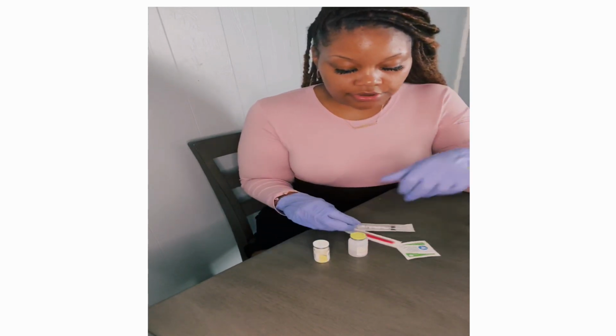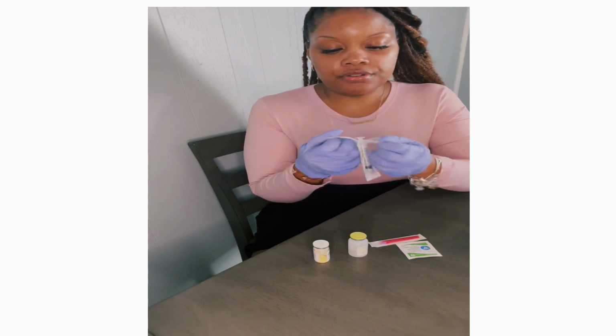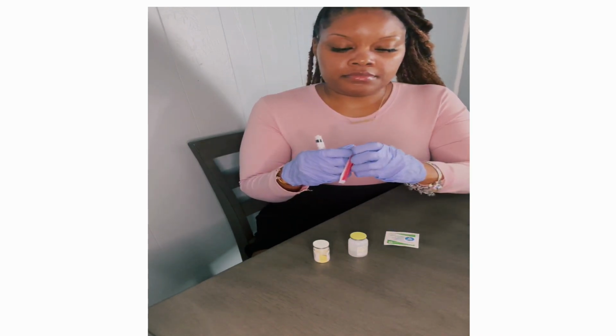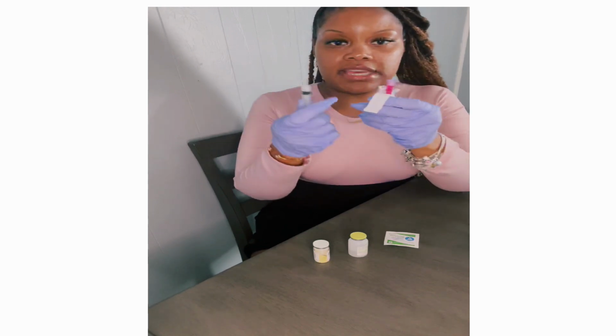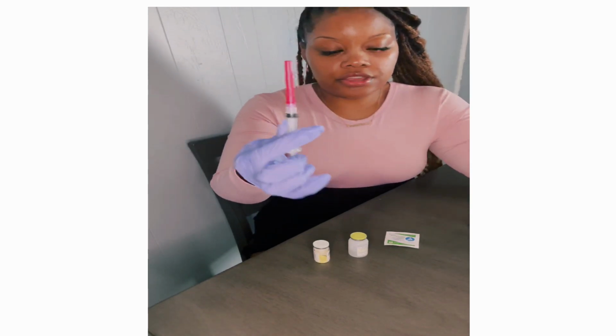All right, so I'm just going to go ahead and assemble my syringe and needle. So all you have to do is take this and then twist it on, and there you go.